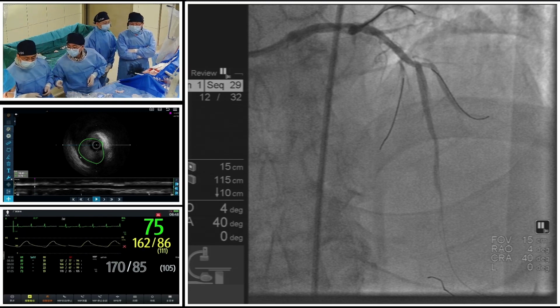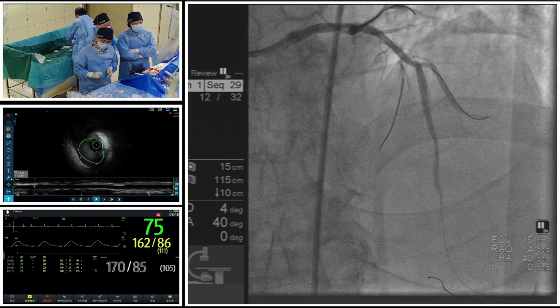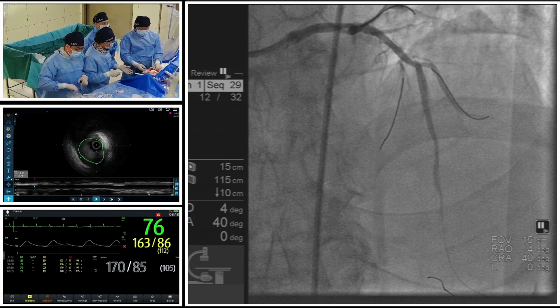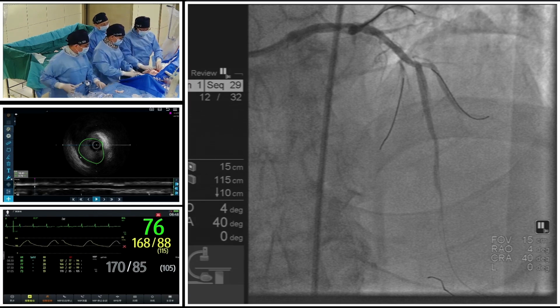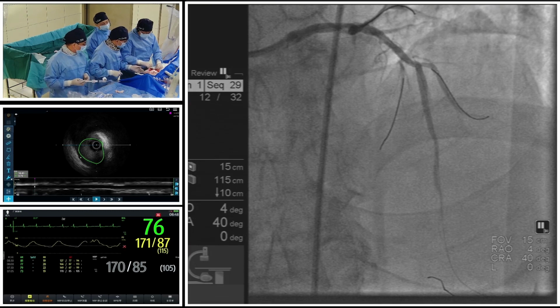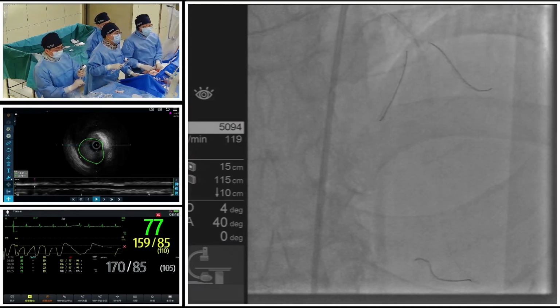The audience wonders about the necessity and importance of this wire in the septal. I think this is of great importance for this patient because you can see that it is almost an isolated septal, one big and isolated septal, so keeping its patency is of great importance. Sometimes the loss of a septal of this size can also influence the heart function of the patient, not to mention angina after the procedure.